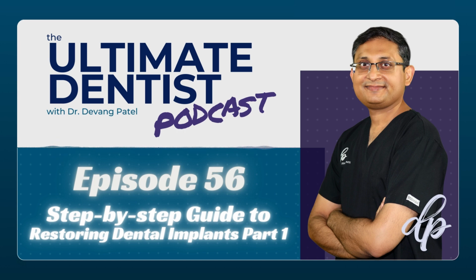Whereas with implants, it's usually mechanical failures: screw loosening, implant abutment fracture, porcelain fracture, or some sort of mechanical issue. You can get bone loss, but it's debatable. We don't know. So considering all these things, there are 12 factors which you need to understand when you are doing treatment planning. So let's look at those 12 factors.